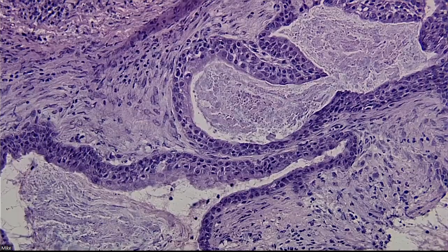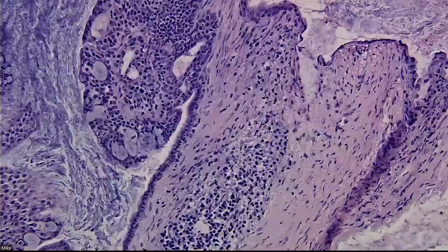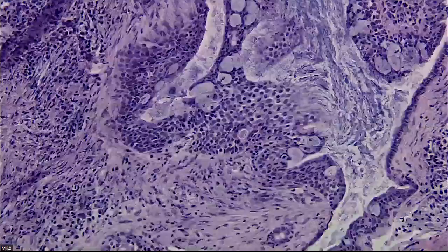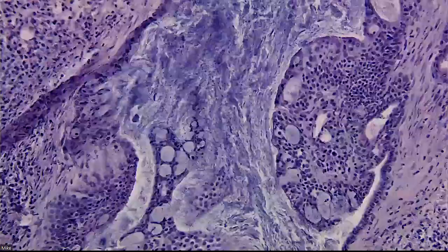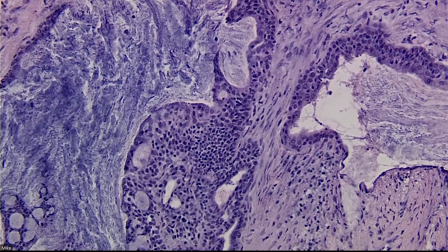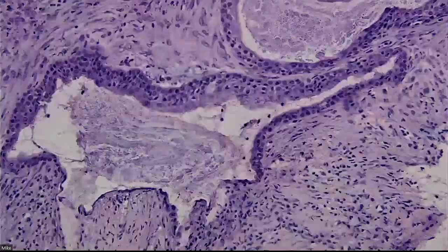Acidic? A little bit, but not really. The epithelium here arguably is thicker than just bilayered, which we know we can see in a Warthin, fine. But are these cells lining the spaces truly oncocytic?